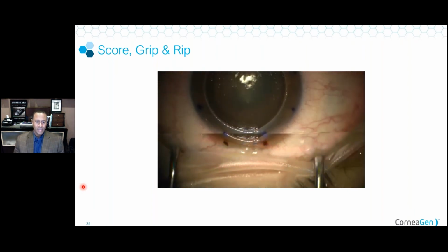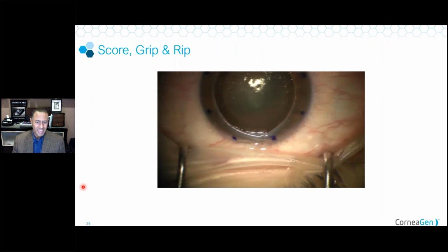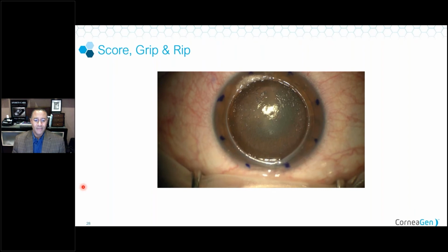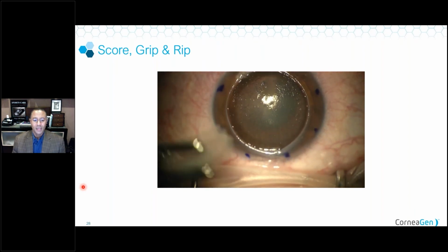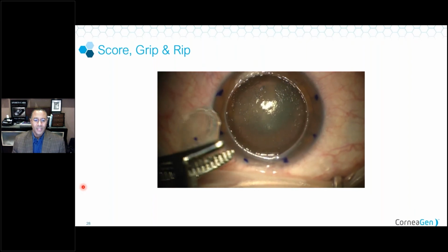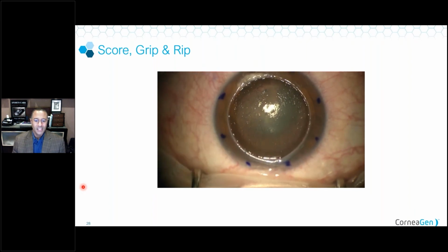Now, again, as I zoom in here and get a little focus, you'll be able to see that there are definitely stromal fibers left. The cornea is thinner in the center than it is in the periphery, but nice and smooth. Very, very smooth interface, much smoother than you can get with a blade, and much safer than you can do with a blade by just tearing it and blunt dissection.